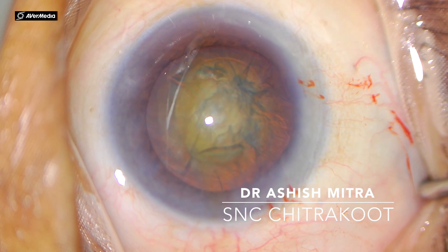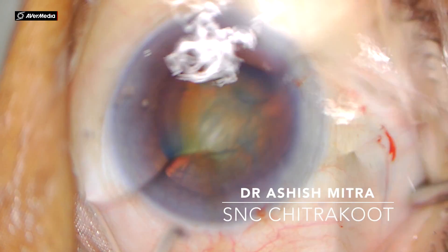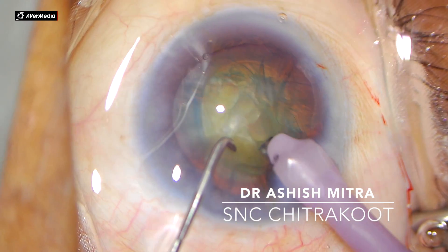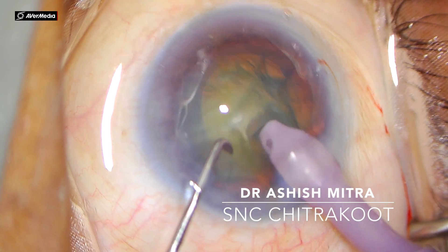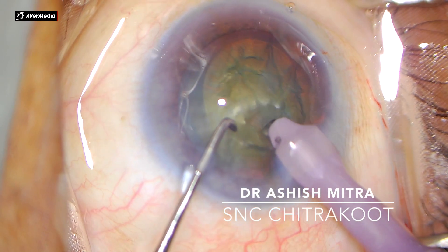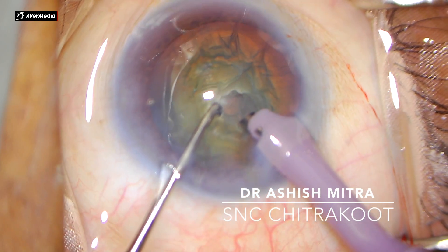Now with the phaco probe I will be going into the anterior chamber. I usually do all my cases in continuous irrigation mode as that maintains the anterior chamber. It is always recommended to make a small and deep trench. As you can see, my bevel is up and slowly the glow would be visible — I'll be pointing towards the glow. I've almost done with my trench.